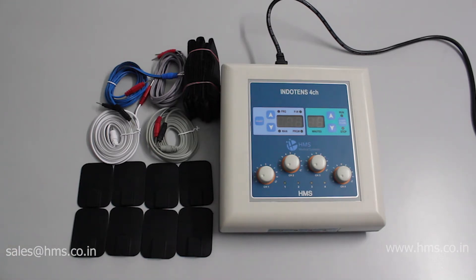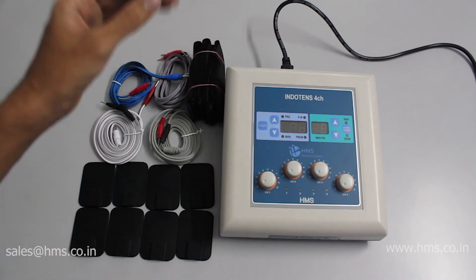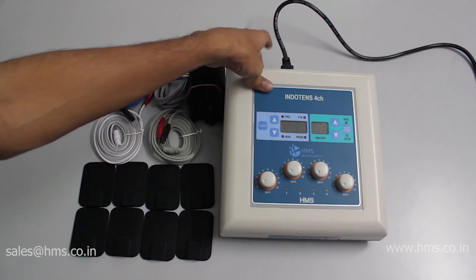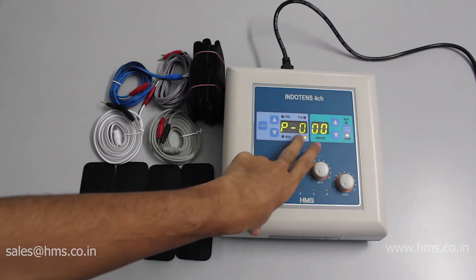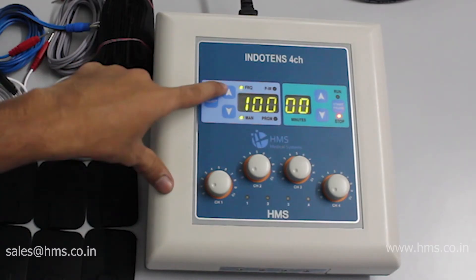Now let's go through the functions of the Indotense 4CH. Switching on the equipment is very simple — just plug in the power cable and press the power button at the back. The machine is now in the on state. Program P0 is the manual mode where you can set the frequency.